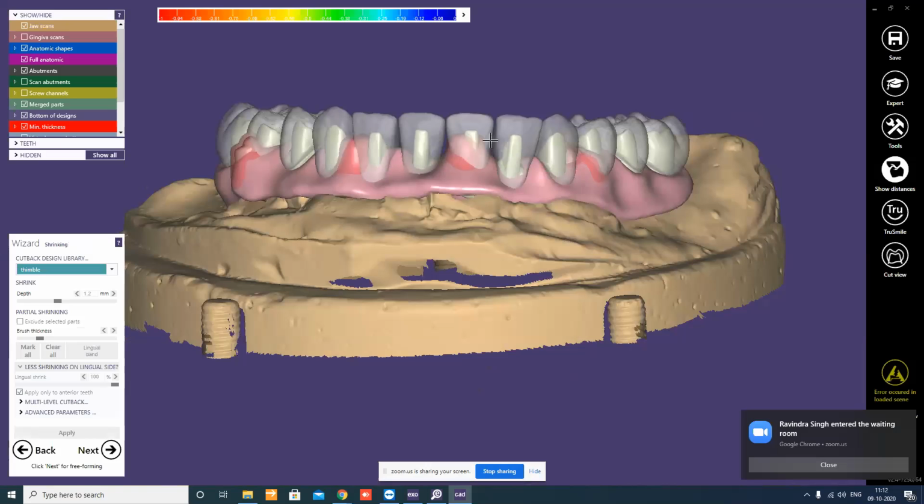Everything looks a little convincing, and okay. Now finally we correct the heights. Now this height I'm not happy about, so I can just pull down the height a bit.